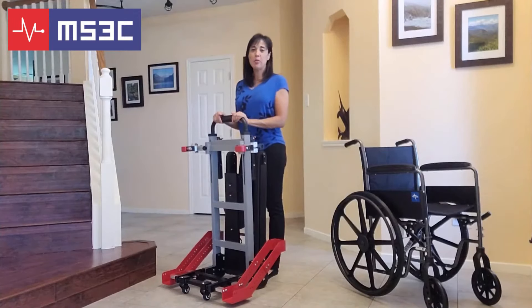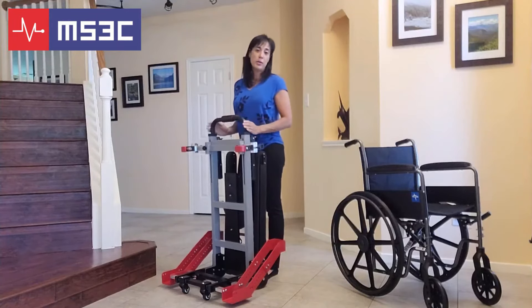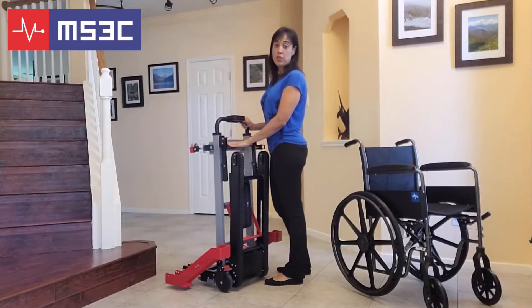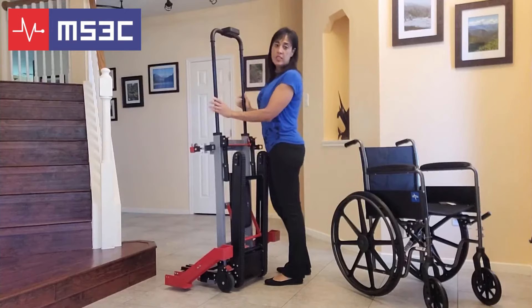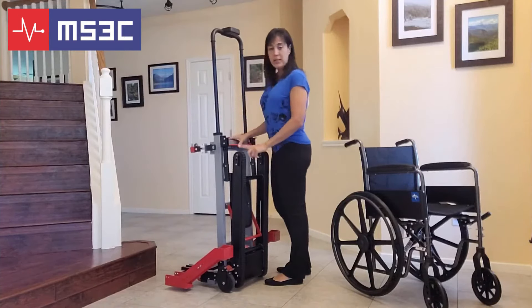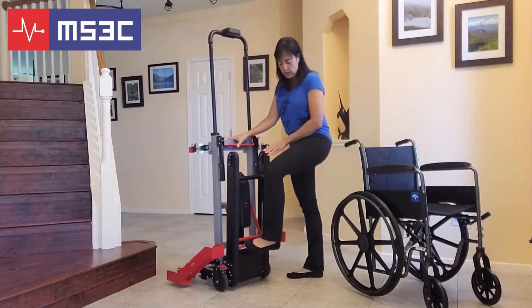Let me show you a couple of the basic operations of the MS3C-300WC. To extend the telescoping handrail, you're going to squeeze the red horizontal bar across the back of the chair and lift. This bar will need to be in the full upright position when in use. To engage the tracks, you push the red lever at the back of the chair.